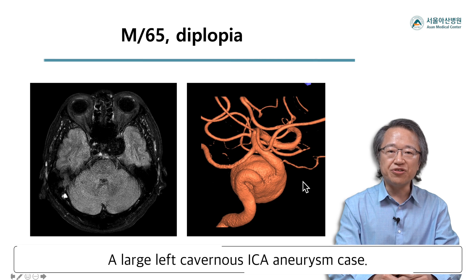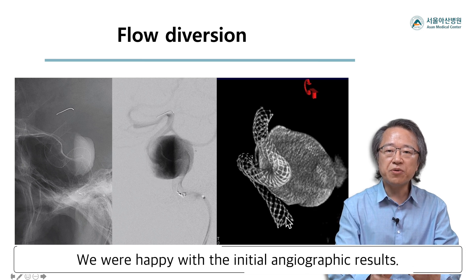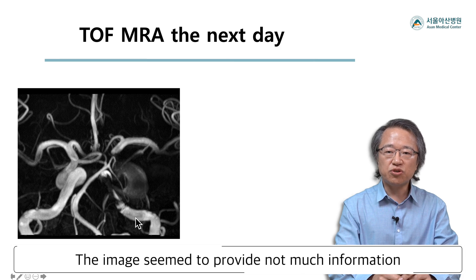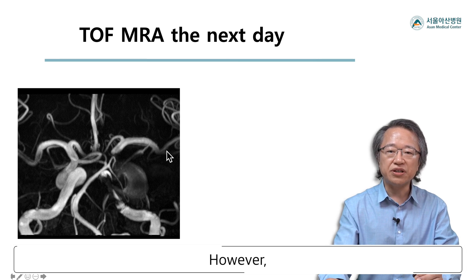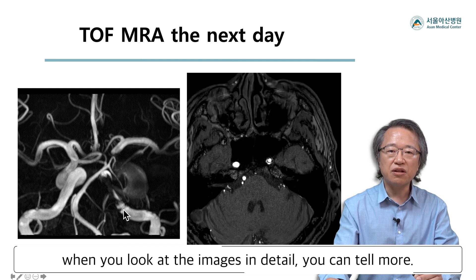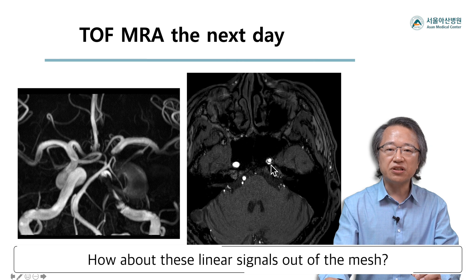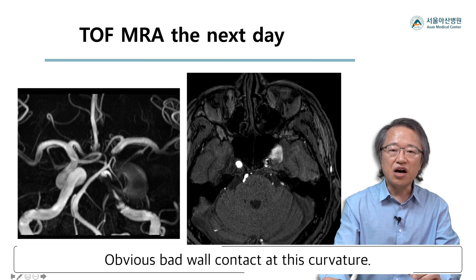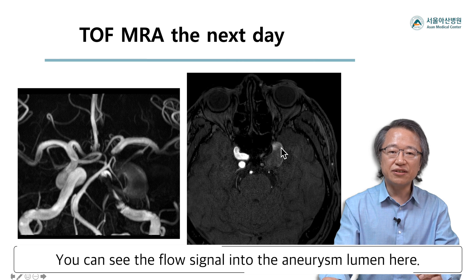A large left cavernous ICA aneurysm case. We achieved good stagnation after flow diversion and were happy with the initial angiographic results. We obtained TOF MRA the next day. The image seemed to provide not much information except for good parent artery flow-related signals. However, when you look at the images in detail, you can tell more. The stent mesh is seen as a ring-shaped signal void structure. There are signals from flow outside the mesh, meaning poor wall apposition — with obvious bad wall contact at this curvature. You can see flow signal in the aneurysm lumen here.